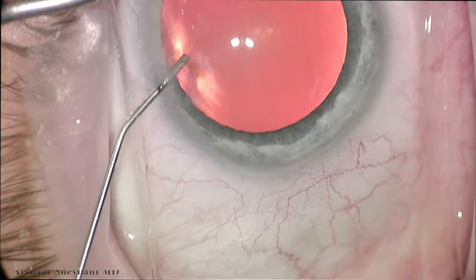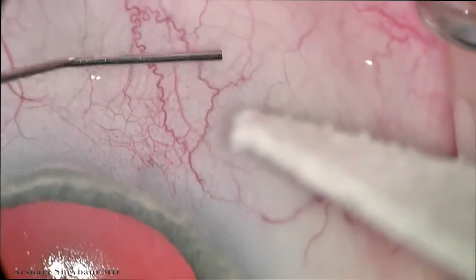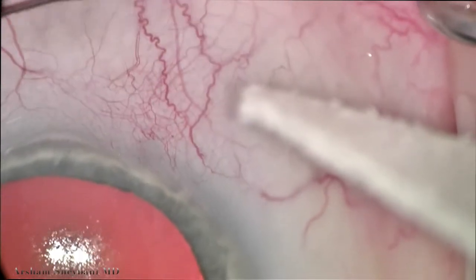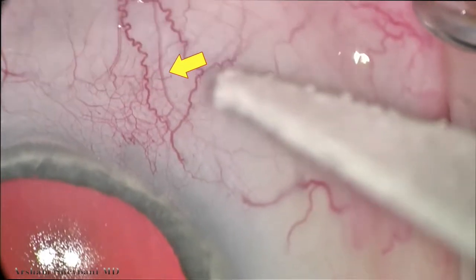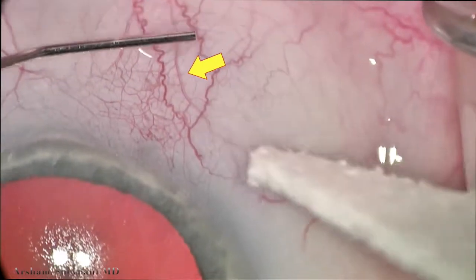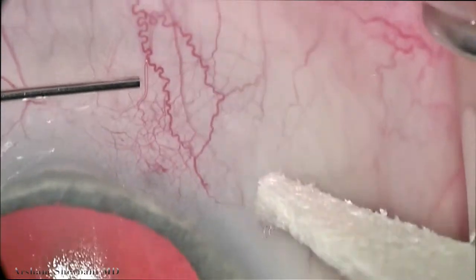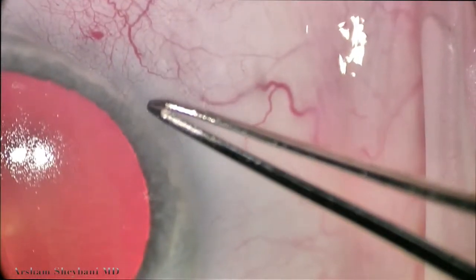This case was a patient with mild open angle glaucoma. We initially inject a balanced salt solution and we're trying to identify these collector channels. You can see there's a striated vessel right there in the center beneath the cannula. You can see laminar flow between the aqueous and the red blood cells, and this is a spot that we're going to want to target our eye stents.